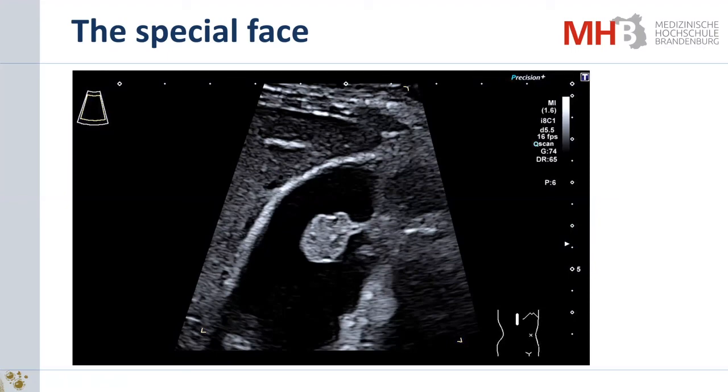Okay, this is a clinical diagnosis, but we are in a basic course and we would like to train ultrasound terminology. Please describe this polyp. It is a polyp, of course. Another one wrote that it's hyperechogenic and no shadow. Okay, this is a good description.